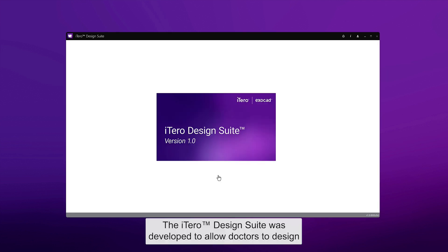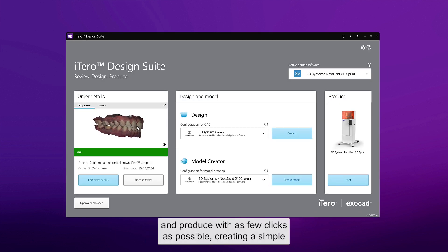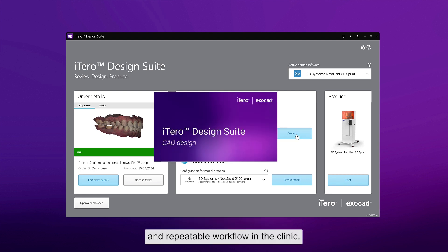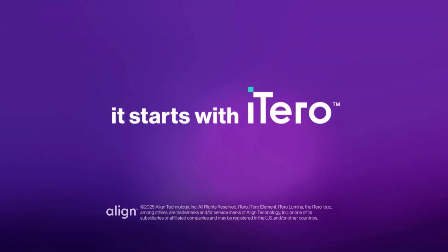The iTero Design Suite was developed to allow doctors to design and produce with as few clicks as possible, creating a simple and repeatable workflow in the clinic. It starts with iTero.